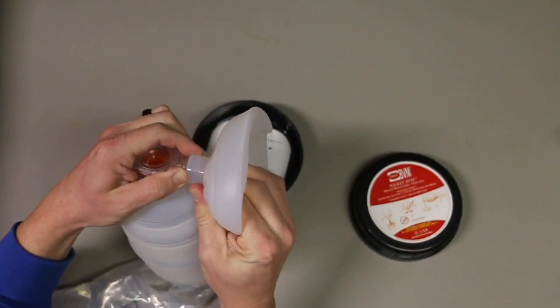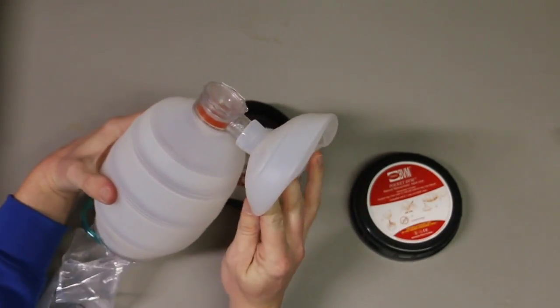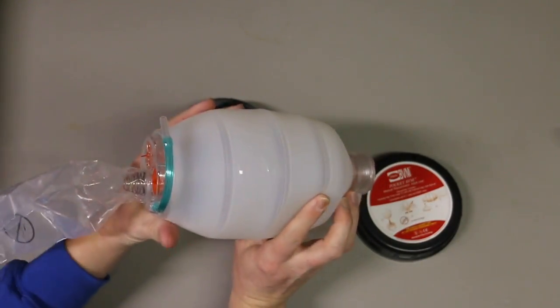Now you don't necessarily have to attach it to oxygen. If you don't have that, you can just squeeze here and the patient's chest is going to rise. I am going to do a more detailed review on this on the Skinny Medic channel.